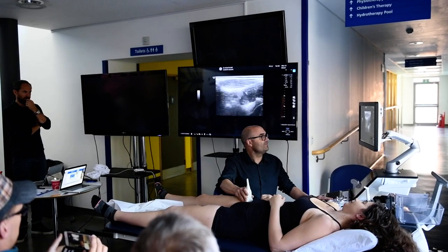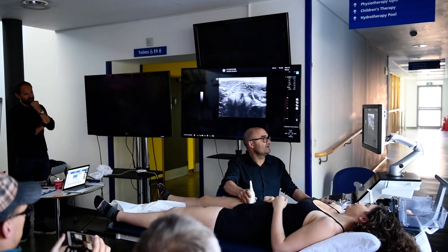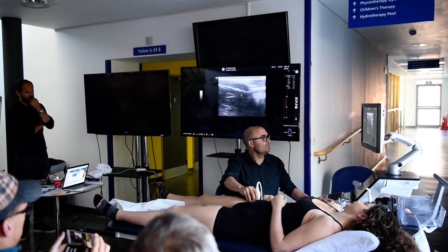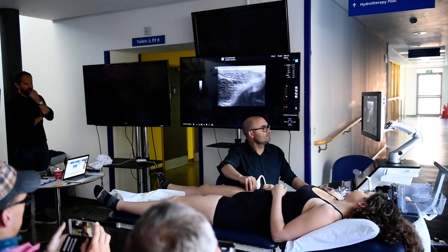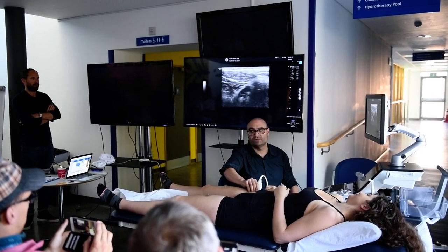So we move down again. We find the shadow of the indirect tendon. We move lateral. We angulate the probe. You have a complete tear of the indirect tendon.